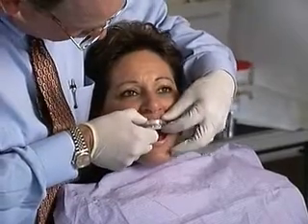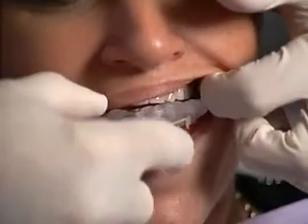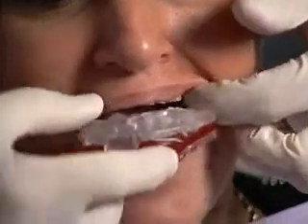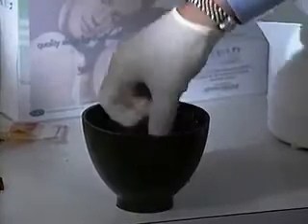Have the patient slide their jaw from side to side while engaging the guides at the front of the appliance. If the teeth do not slide easily, place a small amount of Vaseline on the guides to allow for easier movement. Remove both the upper and lower devices and attach elastics in a triangular design. Reinsert the connected components and have the patient bite down and suck into the device for extra retention. If additional retention is needed, reheat only the affected component for 90 to 120 seconds in boiling water, then reattach the elastics. Place the assembled device back in the mouth and have the patient bite down and suck in. Remove the device after 30 seconds, cool with water, and repeat the steps to increase retention.